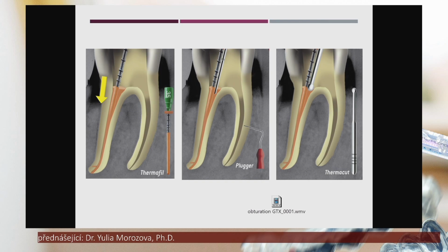In this case, we can inform the patient that they may feel some pain, even when they have anesthesia, because the air that could be present in the root canal will be delivered deeper and deeper, and this is felt by the patient as pain.